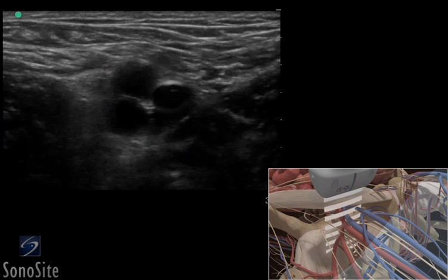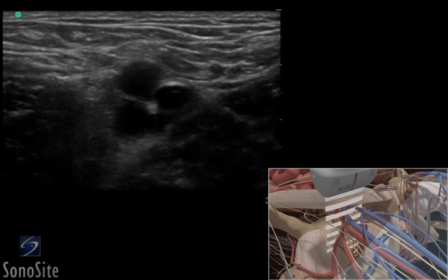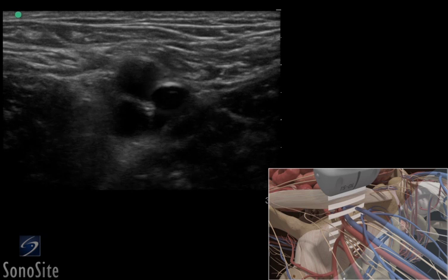The superficial femoral artery is seen as a dark, anechoic, pulsatile circular structure in the mid-portion of the ultrasound image. Deeper and slightly to the right of the image, the femoral vein will appear as a dark, anechoic elliptical shape that is compressible with transducer pressure. Adjust the transducer so it is centered over the femoral vein, medial to the artery.